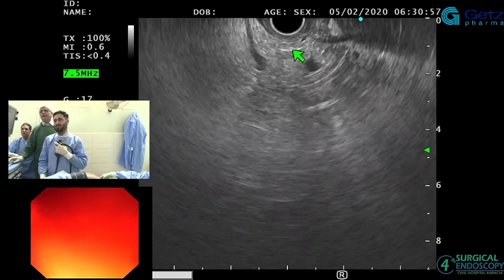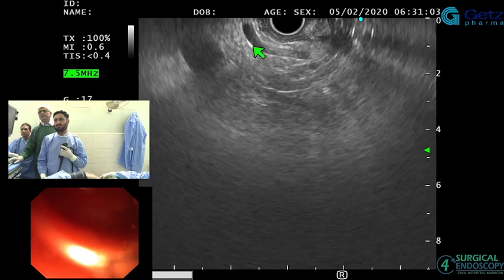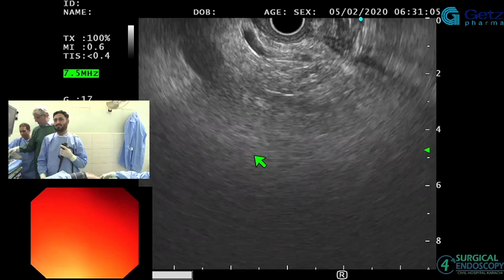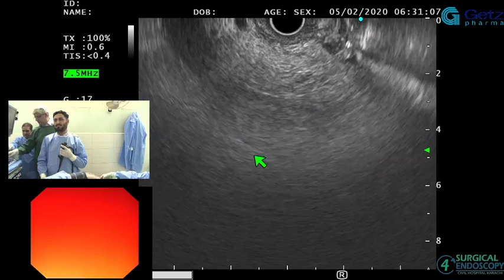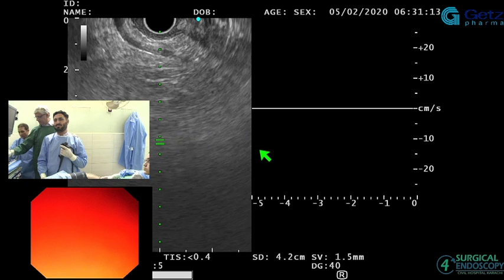Hold it again, sir, keep it on the artery. Again, just get it there if you can. Yeah, just keep it there. So I'll show if we can. Where is the power? And we'll take the cursor away.